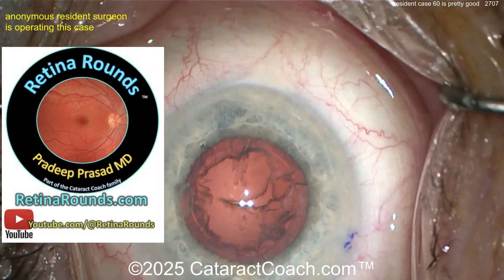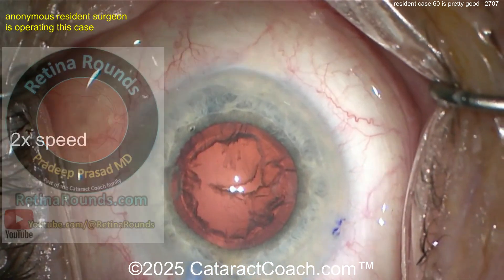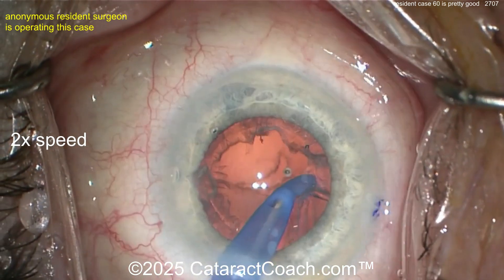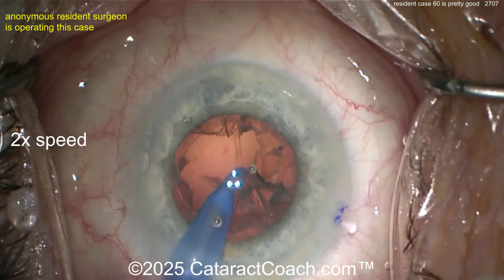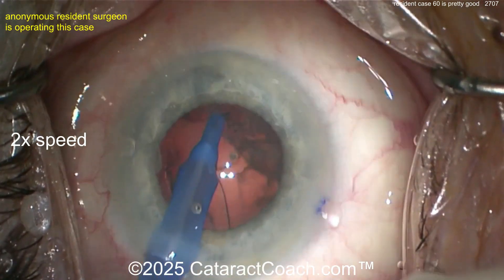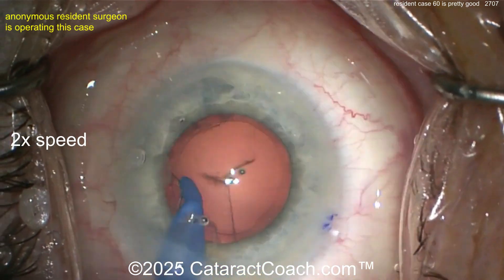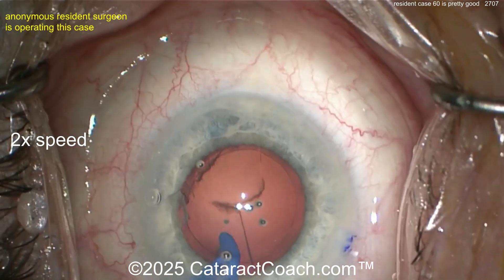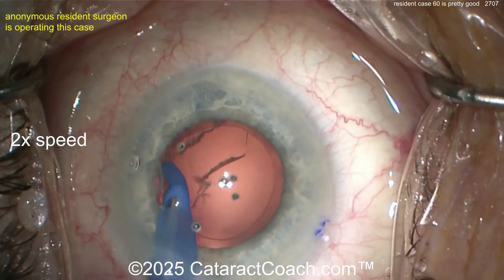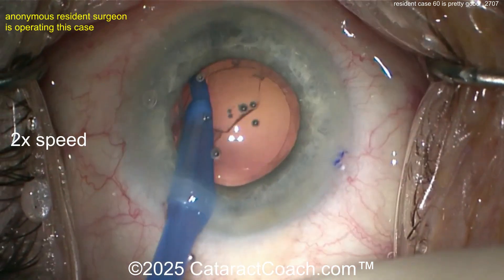If you're a resident, you have to learn retinorounds.com — it's a great sister channel, I promise you're going to learn a lot. Anyway, back to our case. Here's the cortex removal with the I/A probe — pretty good, nice circumferential approach. Again, a nice looking case. You've done a really, really good job.